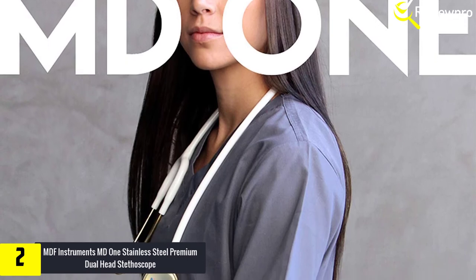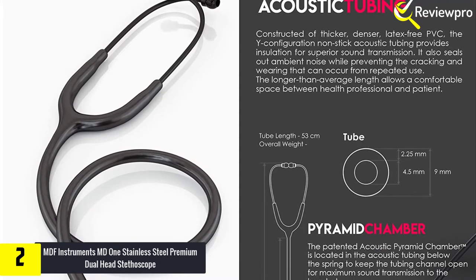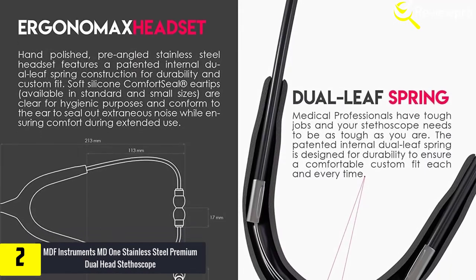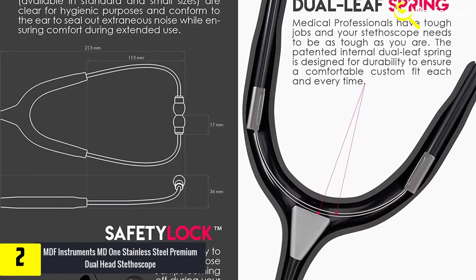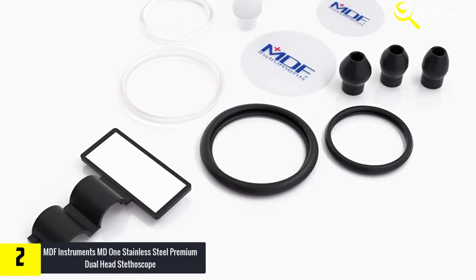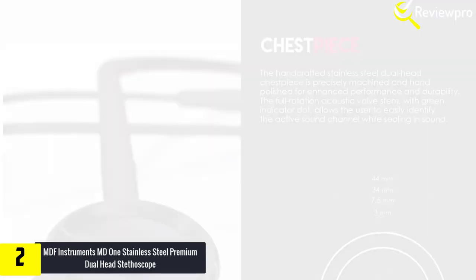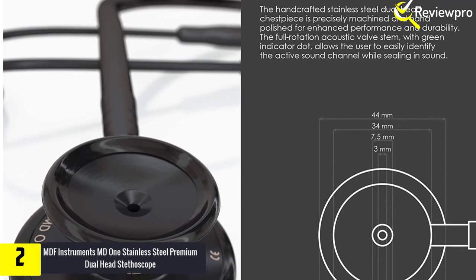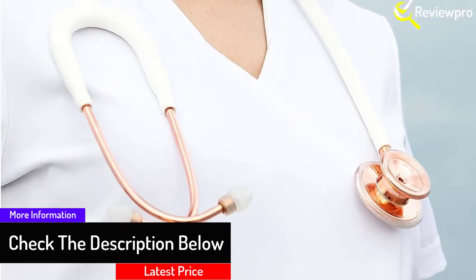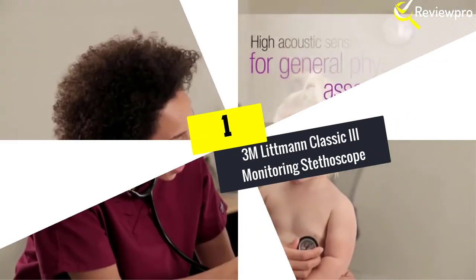At number two, we have the MDF Instruments MD One stainless steel premium dual head stethoscope. Made from industry-standard stainless steel, this premium stethoscope offers accurate and clear auscultation of heart and lung sounds. It features an ergonomic design so both the patient and the doctor will find it comfortable to use. The chest piece has a dual head design for maximum durability, and there is a full rotation valve stem with a green dot indicator for easy identification of the active sound channel. The tubing is crafted from dense, thick PVC that is latex-free. One downside is a tendency for the finish to rub off on upper components, though this can be managed to preserve the instrument's appearance.